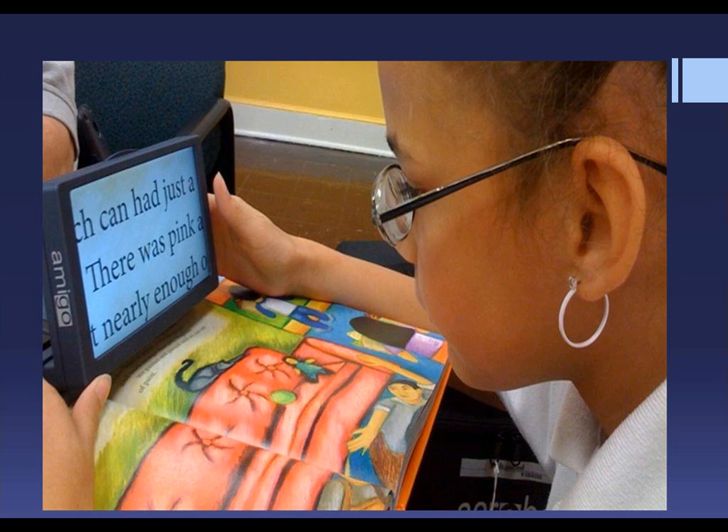This student needs an electronic magnifier in all of her classes. The Amigo is lightweight and portable, and is perfect for carrying from class to class. The magnification level is 3.5x to 14x. She also has the ability to use the larger TV screen at home.